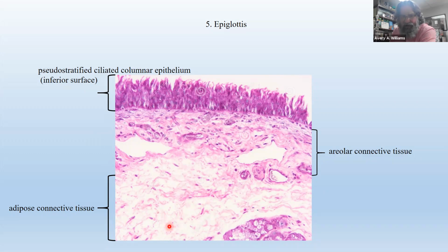And then here's some underlying connective tissue. This stuff right here, I didn't... Oh, well, I did. I didn't label this. I did it over here.